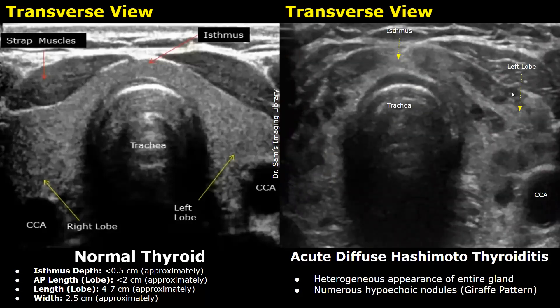This is another case of Hashimoto's thyroiditis in the acute stage. There is a heterogeneous appearance of the entire gland, and you can see numerous hypoechoic nodules inside the thyroid. This type of appearance is termed the 'giraffe pattern' because it resembles the pattern of a giraffe's hide.